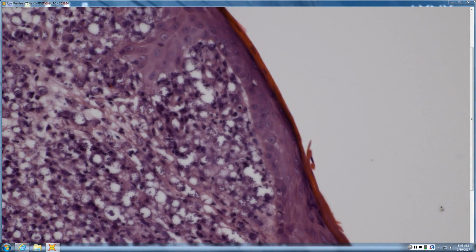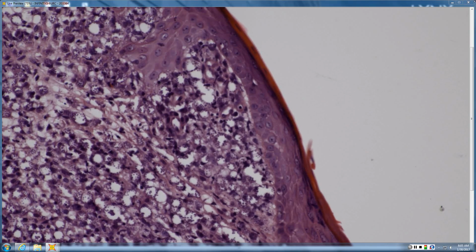And then in the differential for leishmaniasis, if it were more evenly spread, histoplasmosis, Penicillium marneffei. And then the other one that can do that is trypanosomiasis, which we don't have a whole lot of in the U.S., but trypanosomiasis is related to leish, and the organisms look similar in tissue. If it's a cutaneous ulcer, it's more likely leish.